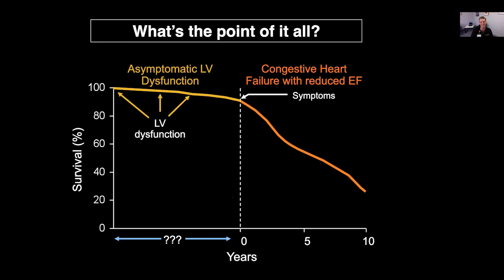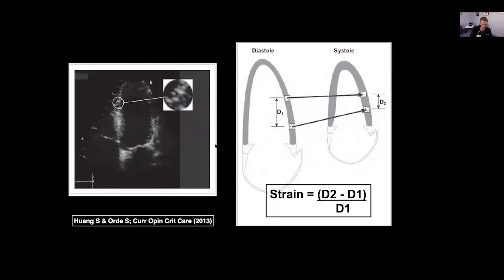Again, that's very research-based, but in the cardiology literature, this concept has certainly been shown to be of use in things like oncology, with chemotherapy-induced cardiotoxicity. We know that global longitudinal strain can pick up problems before they are picked up by ejection fraction. This is the kind of technology that has helped prevent serious heart dysfunction, because chemotherapy is changed, reduced or stopped when you start to see earlier cardiac dysfunction. So it has some premise of being useful in the cardiology literature.